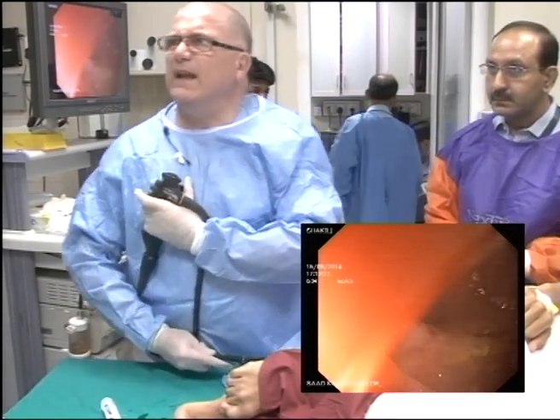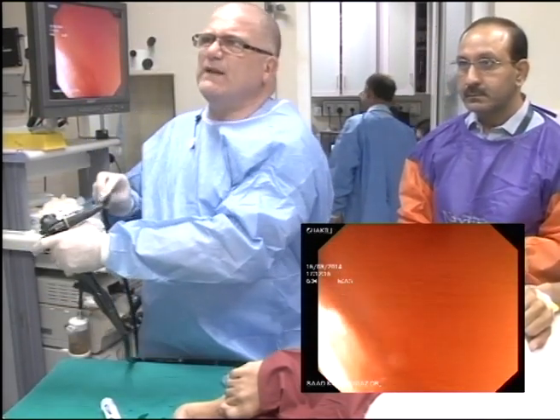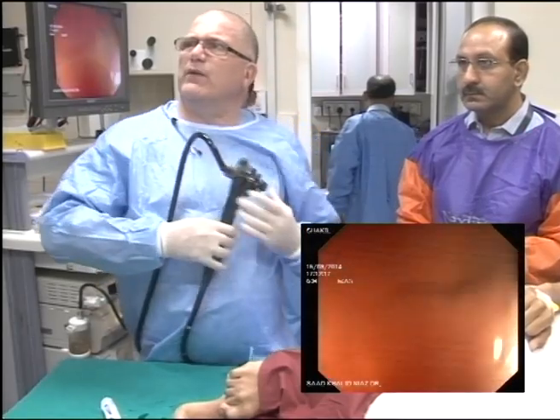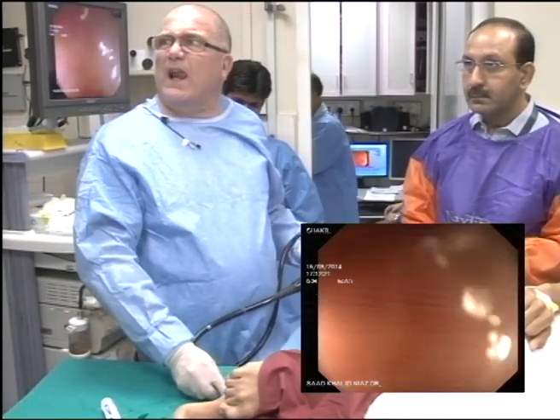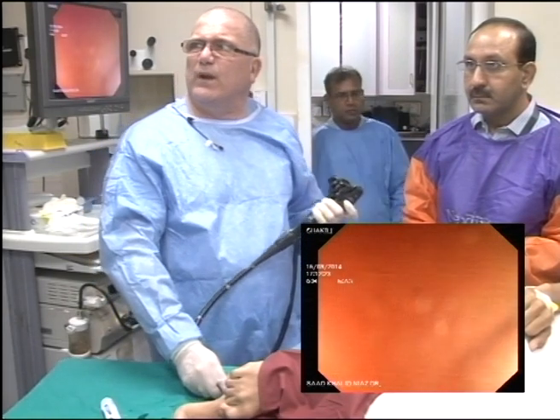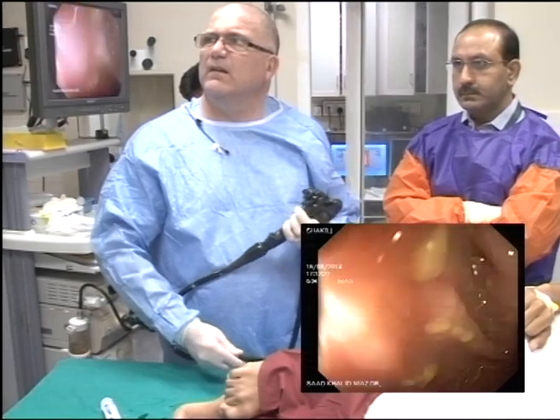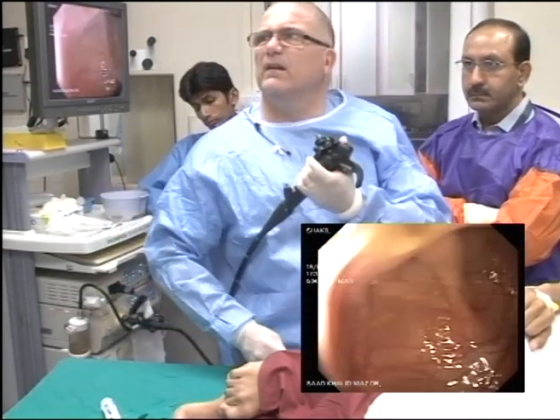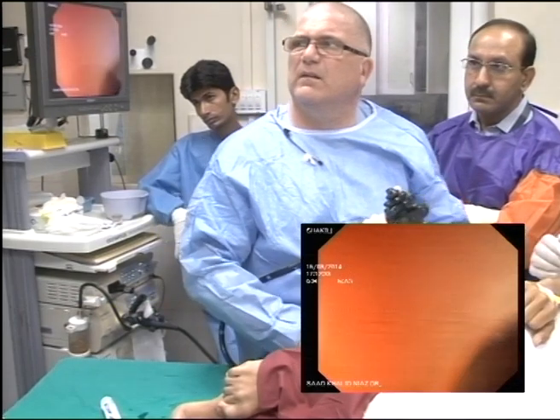So when I come back here, I'm actually drawing back the scope slowly. Now I'm going to take that loop out, but I'm going to turn the scope so she sits off to one side, so I don't allow that anti-clockwise torque to fully come off yet. How much scope has come out? How much scope was in the loop?